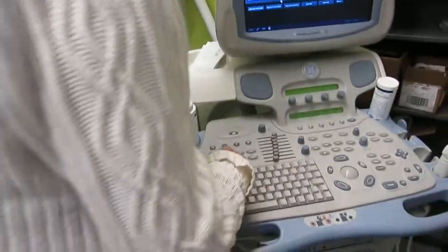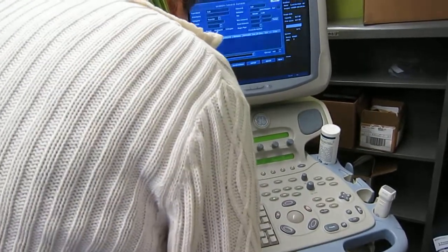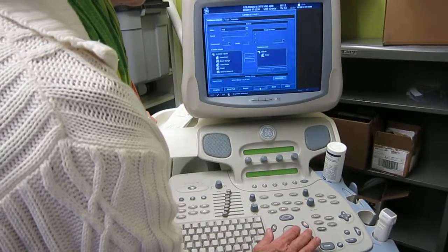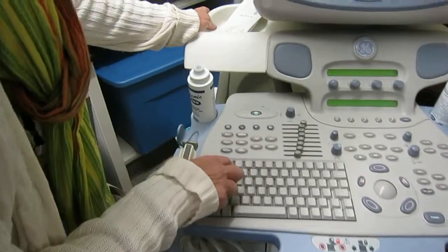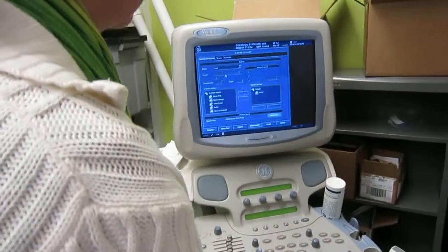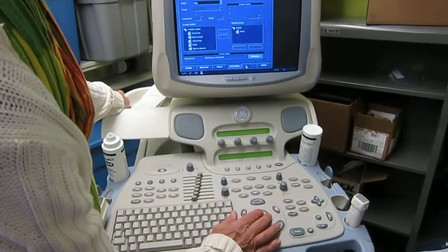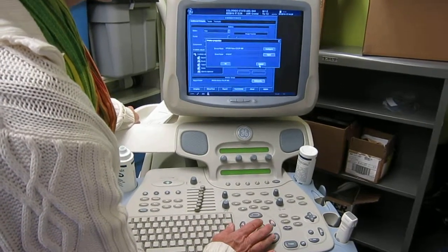Might be able to get it to default to the. Hang on. How did you get to this menu? There's a utility button right here. It's actually configuration. Okay. Probably between the two of us, we'll get enough.